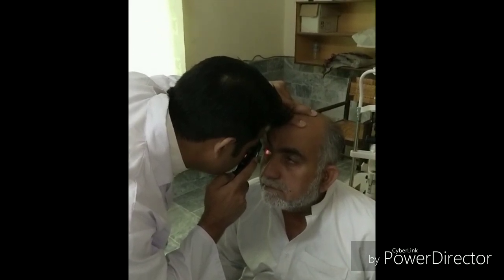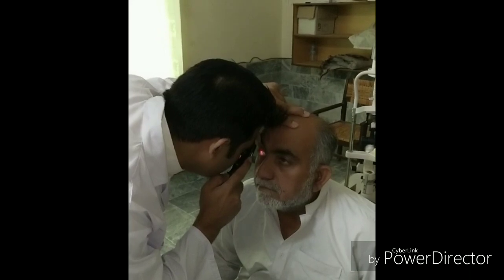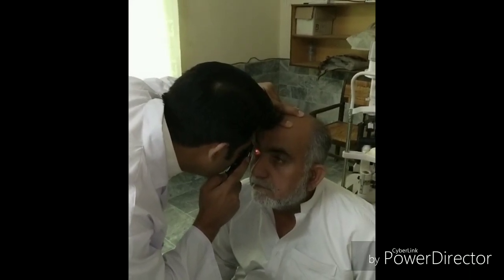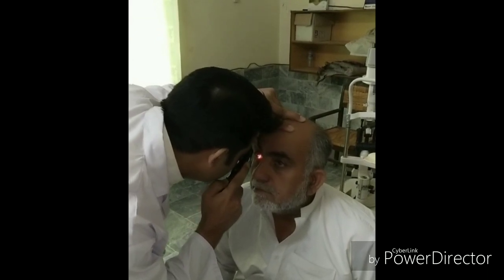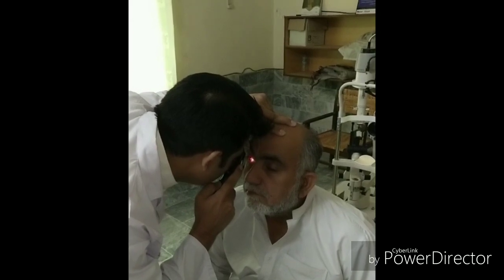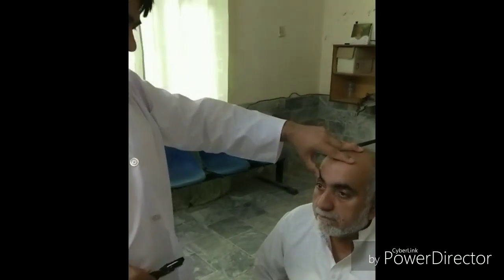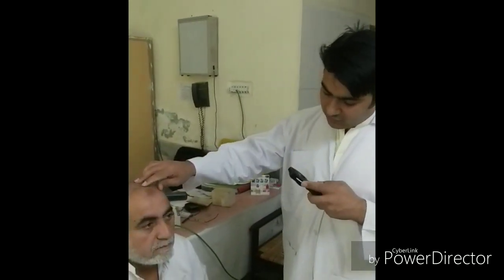Tell the patient to look at a distant target so that you can focus on the optic disc. If you can't see the disc, follow the large retinal vessels into view and by following those vessels you can reach the disc. Then comment on the optic disc cup, the color of the optic disc, and the contour and shape of the optic disc. Then observe all four quadrants: superior temporal, inferior temporal, superior nasal, and inferior nasal.